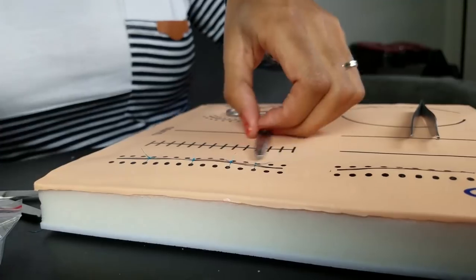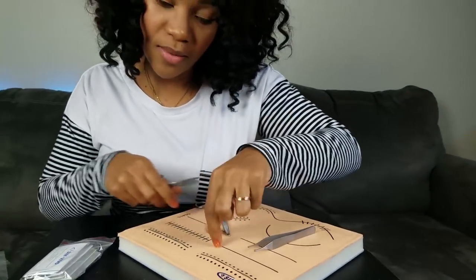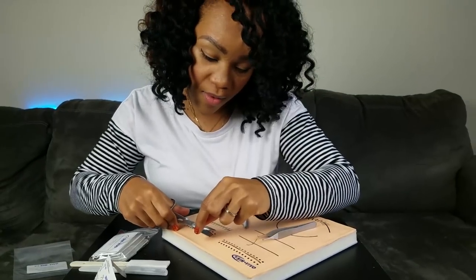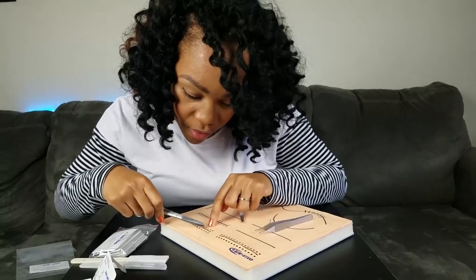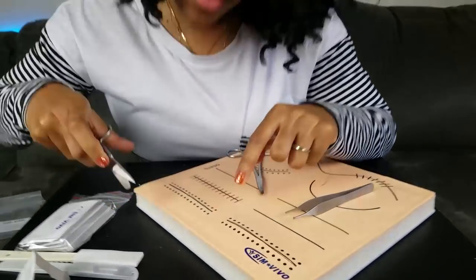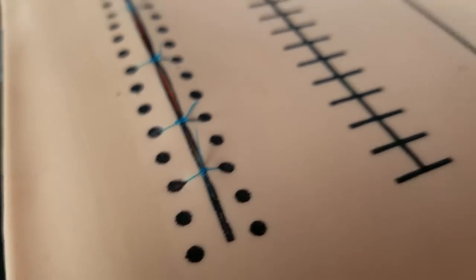making it easy for me. I'm gonna be a pro after this. After I'm done with this, pull this off. I'm gonna cut it. Okay, so it kind of went into the skin there, but it's there. But these are my simple interrupted.